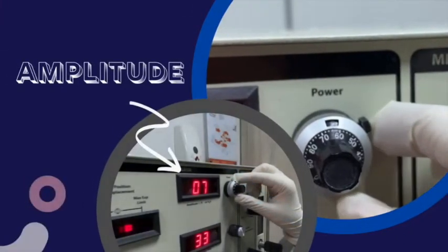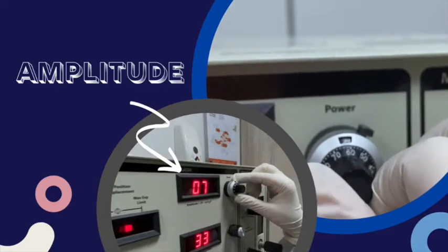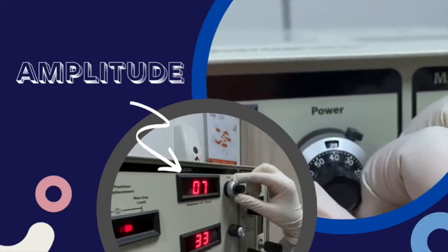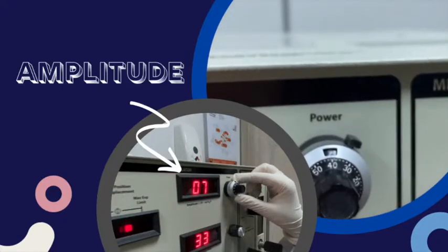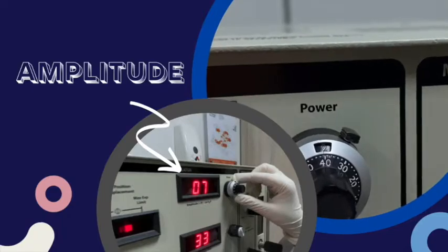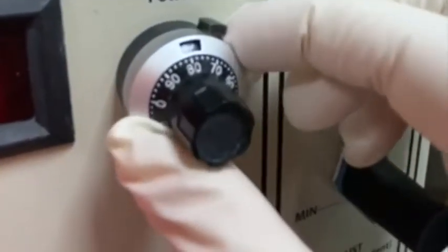Amplitude, the difference between the maximum and minimum pressure of an oscillation, is the key setting for ventilation, which is the delta P or power variation around the MAP, a rough representation of the volume of gas flow in each high frequency pulse or breath. Adjust the amplitude until you achieve a vigorous chest wall vibration.